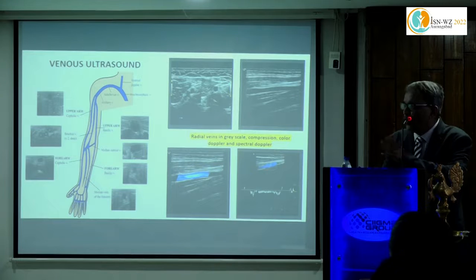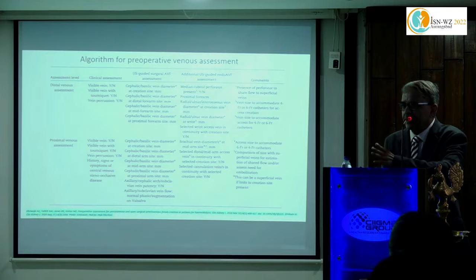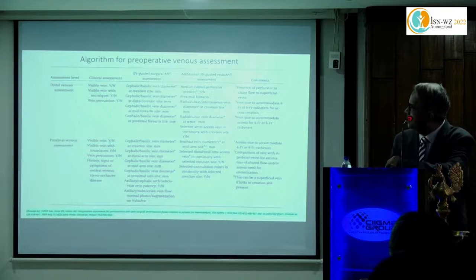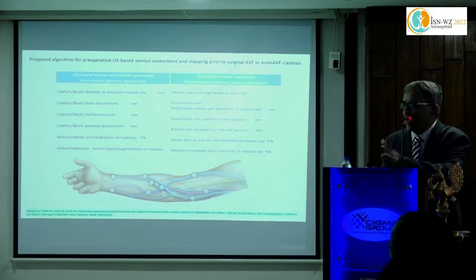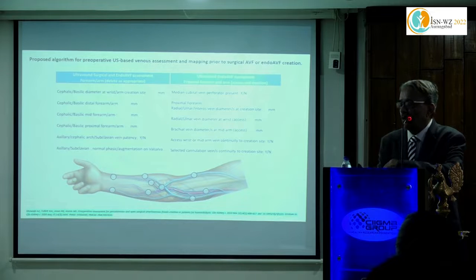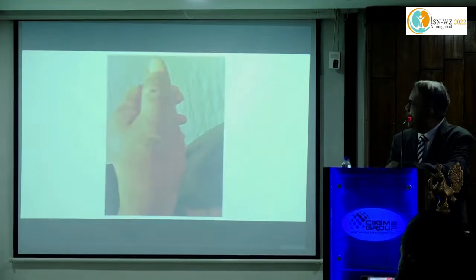In the venous ultrasound, we won't go into details. Next speaker again. Algorithm for veins, again, that will protect you from medico-legal cases. Same picture here. You need to record diameter, you need to record the patency of central veins, you need to record the most suitable diameter of the vein, and compressibility, distensibility, all those factors.